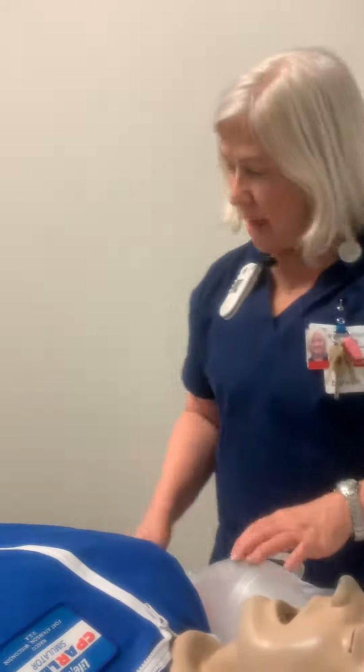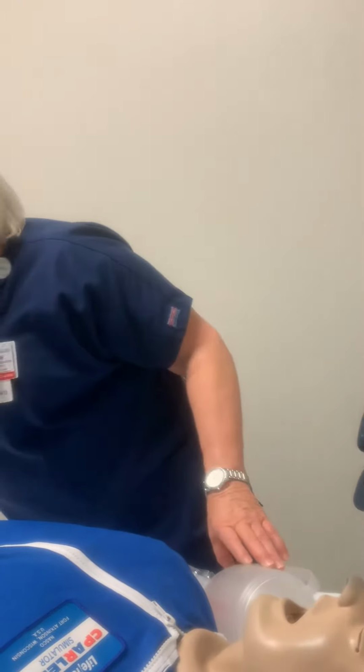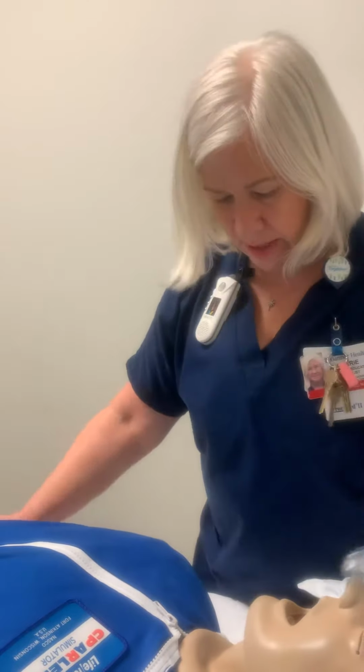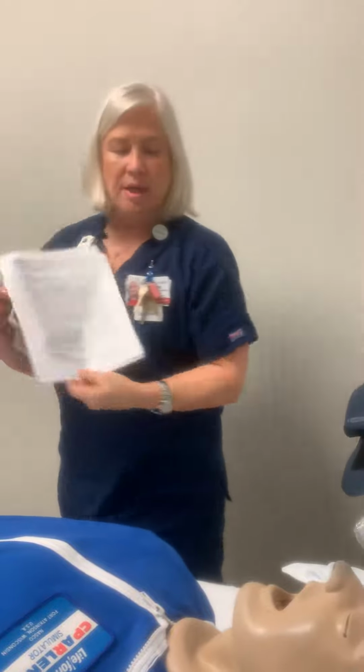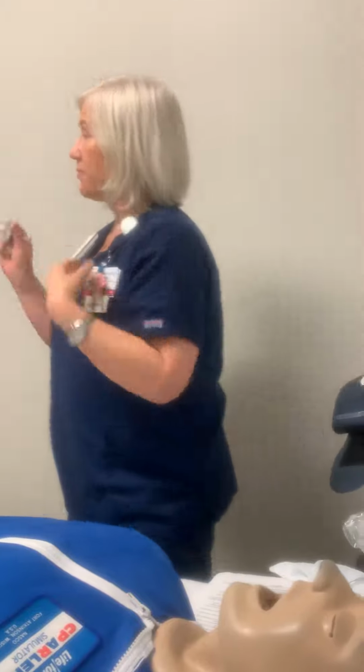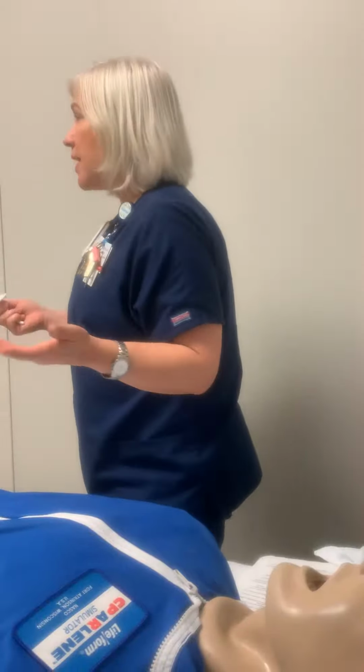Okay, so now we have that one there with that trach that has fallen out. But if I decide now, here at Gateway, per the policy, and I'm gonna let y'all read the policy later on if you want, the policy here at Gateway is a little different from the other facilities around Banner. Nurses can reinsert these trachs, but you have to be validated. And there's no nurses that are really validated to do this.